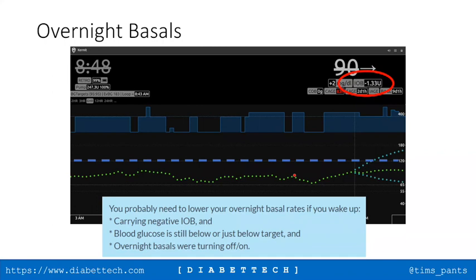Just one question. How many days would you look at this data before doing any change on your system? Because if it's every day, then it's logic you change. But if it's 1 or 2 days, so I would always say 3 days. 3 days, okay. I would always say 3 days. I don't think it's a pattern until it's happened at least 3 times repeatedly. Other people can jump in with what their points of view are on that, but I've always said it needs to be 3 times the same thing happens effectively on a daily basis for you to be able to make the call that it's actually a pattern.